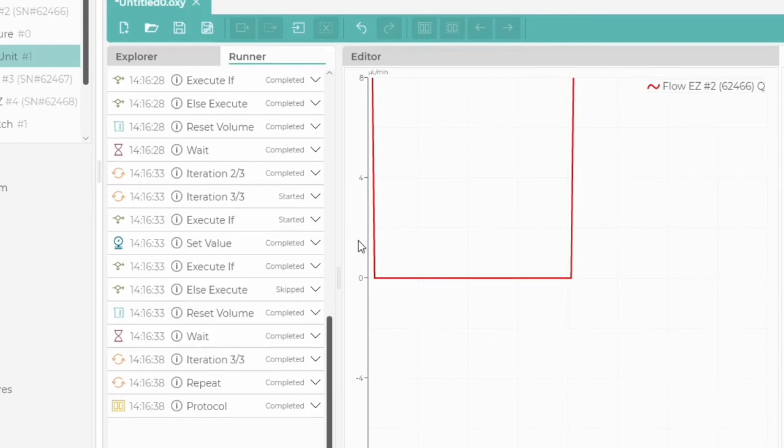Note that on the Runner tab, we see the operation status of each block. For example, you can see which condition blocks were completed and which were skipped.